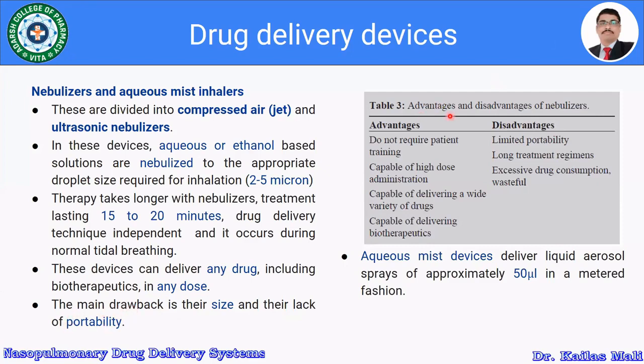Let us see the advantages and disadvantages of nebulizers. First of all, the advantages. Nebulizers do not require patient training, are capable of high dose administration, capable of delivering a wide variety of drugs, and capable of delivering biotherapeutics. So these are a few advantages of nebulizers.